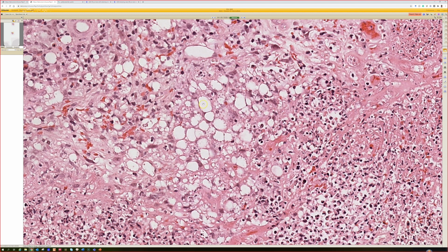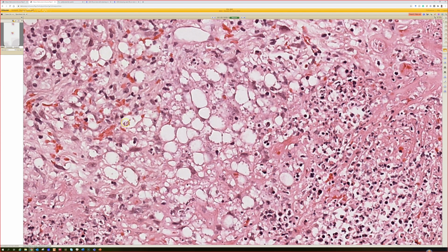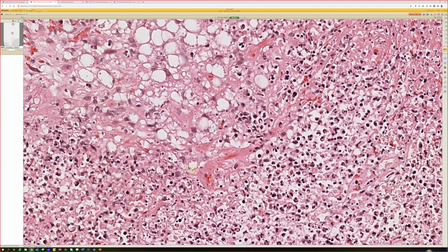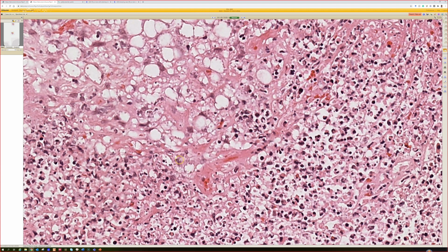When you see spaces in the dermis with a bunch of histiocytes and neutrophils, filled with little tiny round dots of organism, the two main things to think of are Leishmaniasis and histoplasmosis. And people say you can tell them apart because leish tends to line up around the outside of these vacuoles, right? People call this the marquee sign, like the lights around the sign on an old-timey movie theater, or like a Ferris wheel. Whereas you're supposed to not see that as much in histo.